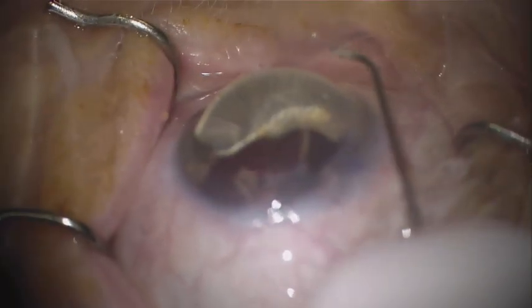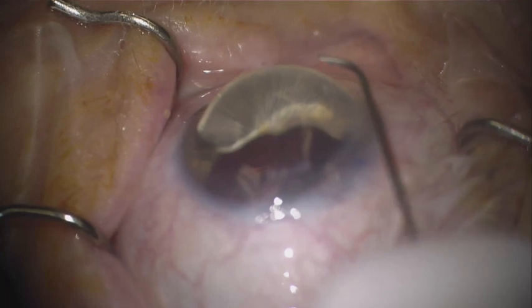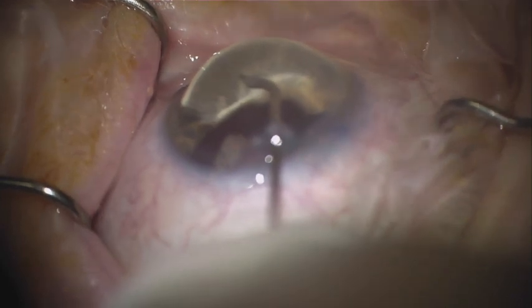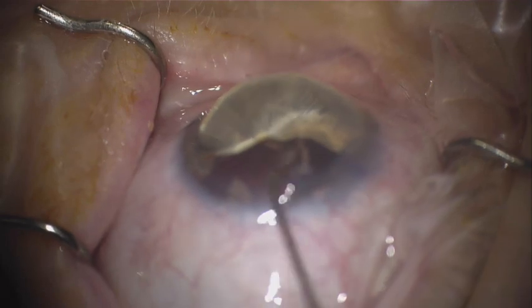Now here, we are evaluating the tip of the Omni, making sure that there is easy deployment of the microcatheter.